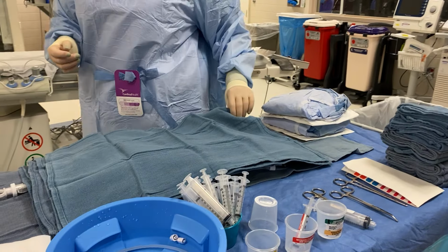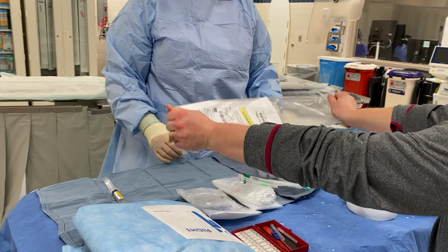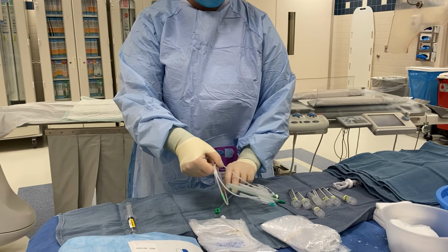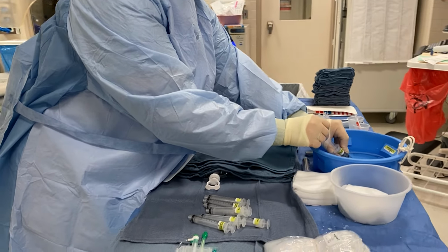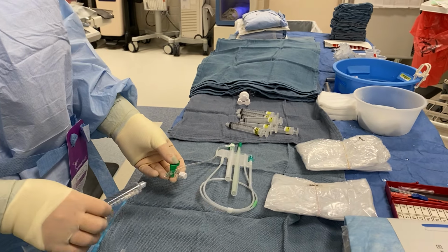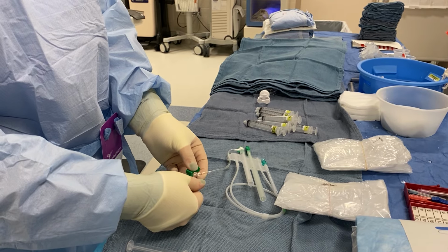Now that we know what our intended access is for the procedure, Heather's gonna open my sheath for me. Thank you. And we're gonna go ahead and flush it and make sure that it's all prepped for the procedure. So I'm gonna take one of my syringes for saline and fill it up. And I'm just gonna give it a flush. So I'm gonna hook up to the end of my stopcock here. We'll take this cap off.